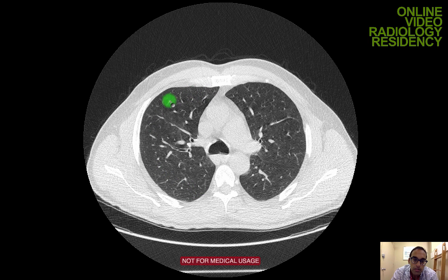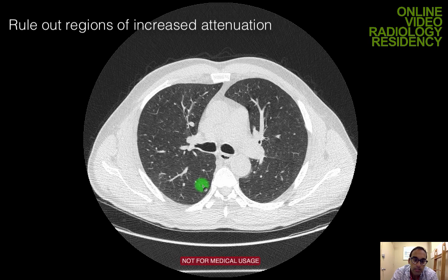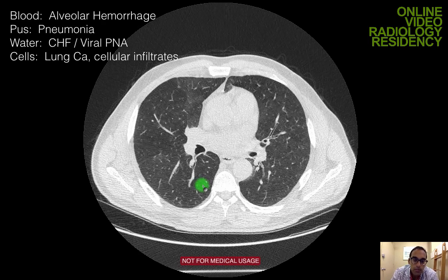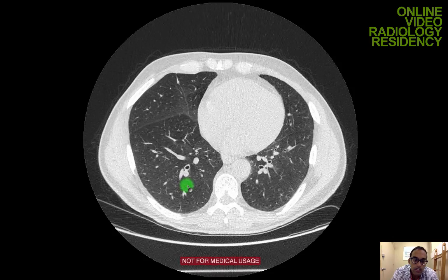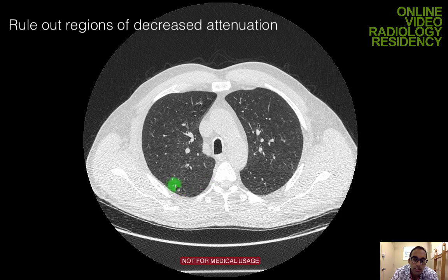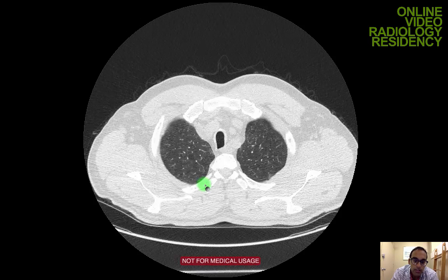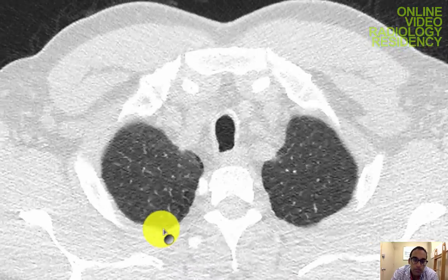I'm trying to exclude increased attenuation of the lung parenchyma — the typical abnormality where the airspace is filled with blood, pus, water, or cells. There are also categories of lung disease with cystic changes or increased lucency. This patient has a very mild form: small cystic changes in the lung periphery, especially at the lung apices in the subpleural lung — that's just mild emphysema.